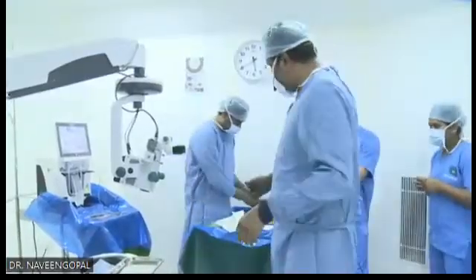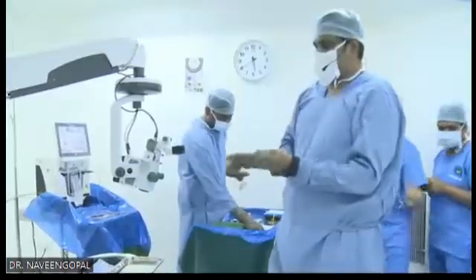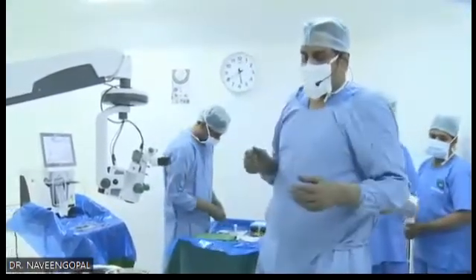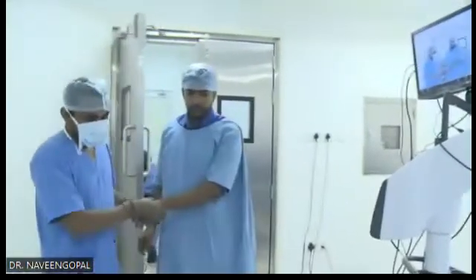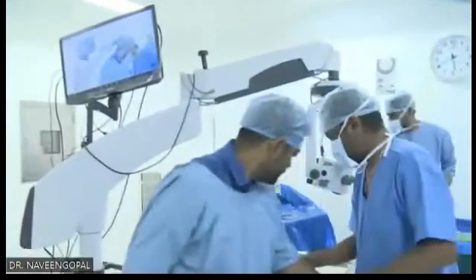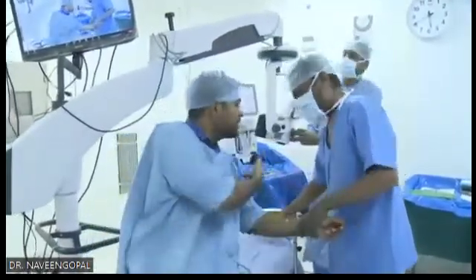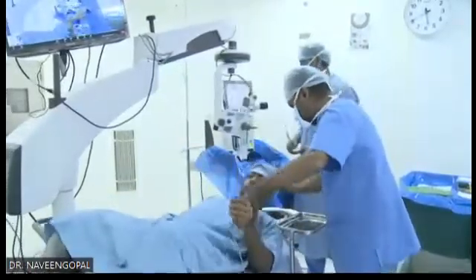Patient is a 26-year-old male with a power of -10 spherical with -2.5 cylinder, white to white of 12, ACD of 3.24. All the angles are open. CD is normal. Retina has been checked by me and the retina surgeon. All the angles are open. That is very important before you put the ICL.